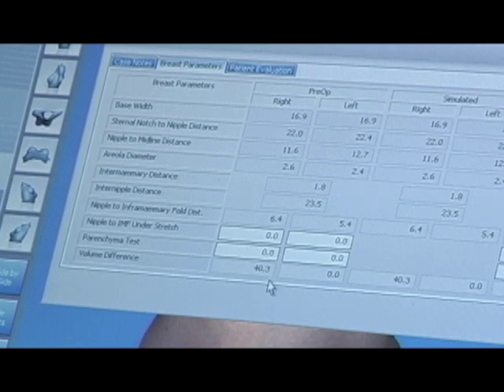Also notice that the computer produces an estimate of the difference in size of the breasts. In this case, the computer estimates that the right breast is 40.3 cubic centimeters greater in volume — or larger — than the left.